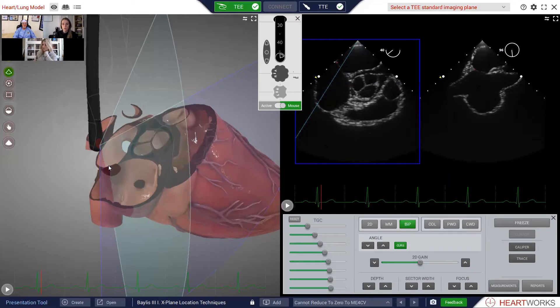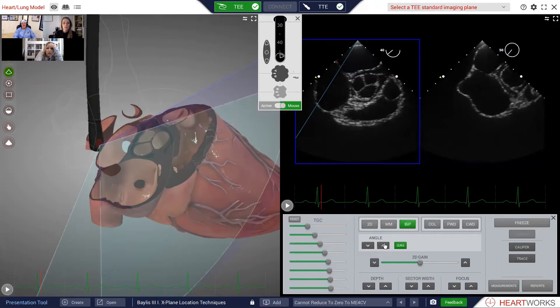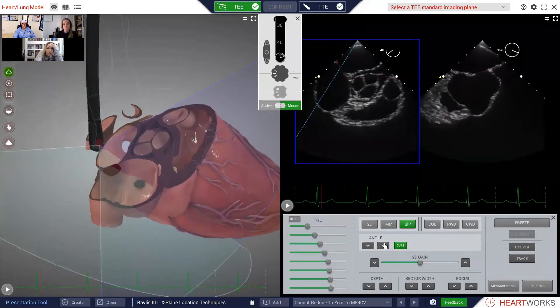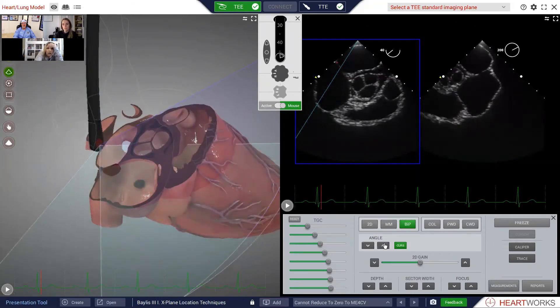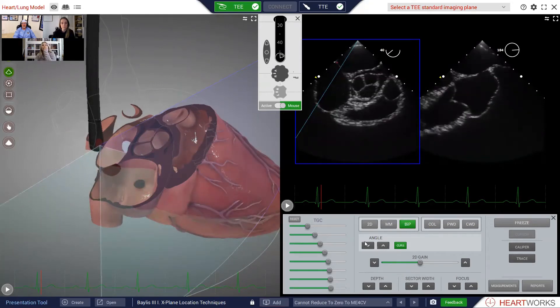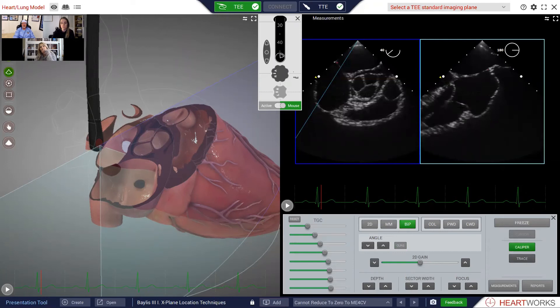We could sacrifice the bicaval view and make it into a four-chamber view. How would we do that? You can go the opposite direction — yes, exactly, that's exactly what you do. The only downside is that you get a flipped image, so you go to 180 degrees and then make your measurements. The only caveat is that you're not measuring height above this valve — you're measuring height above this valve here.